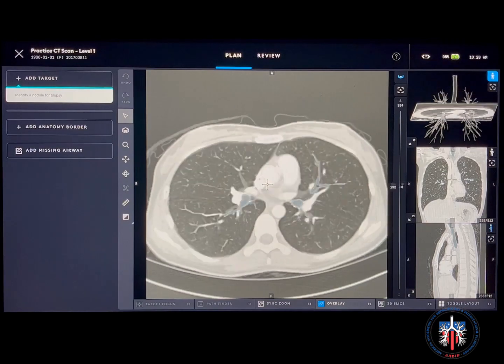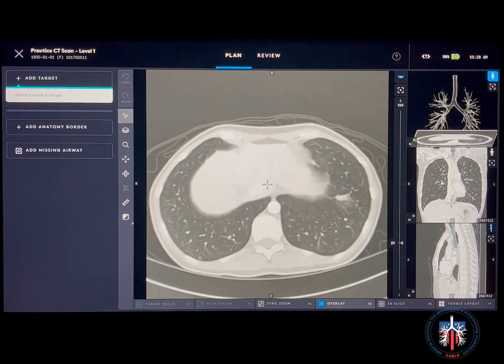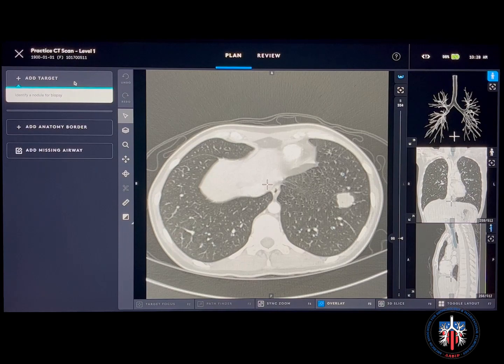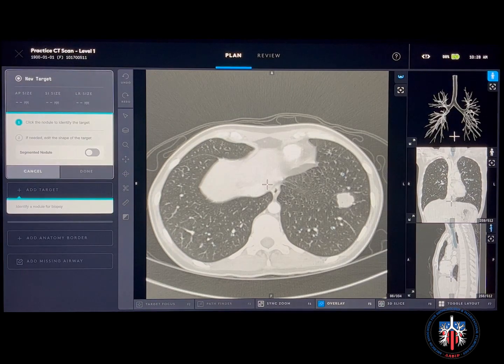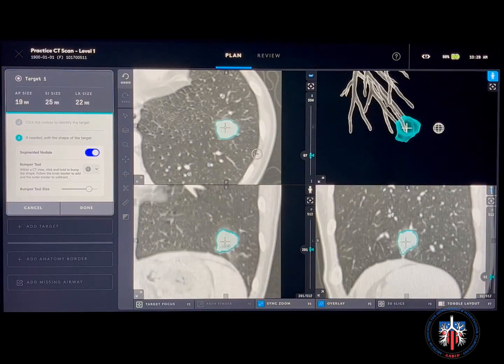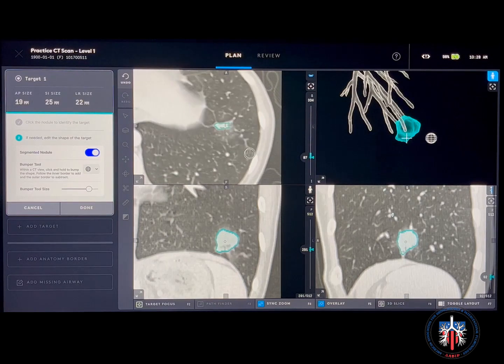In this case, the target is a nodule in the left lower lobe. To choose your target, click add target in the left upper corner and select the target nodule on the CT scan. The system will automatically create a segmented nodule.